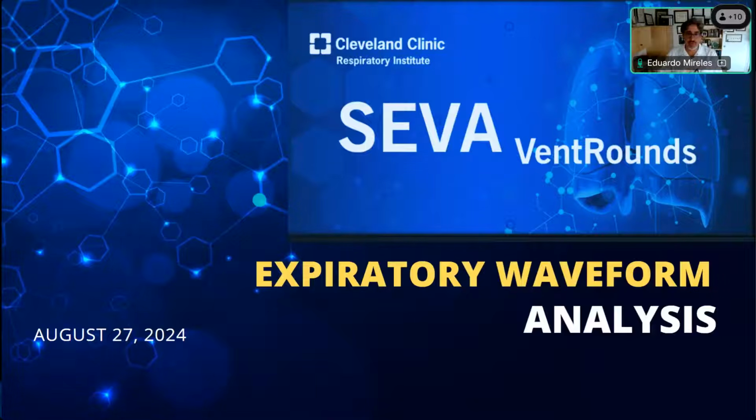Welcome to SEVA VentRounds. Today we're going to talk about the expiratory waveform and a little bit about the analysis of the expiratory waveforms.